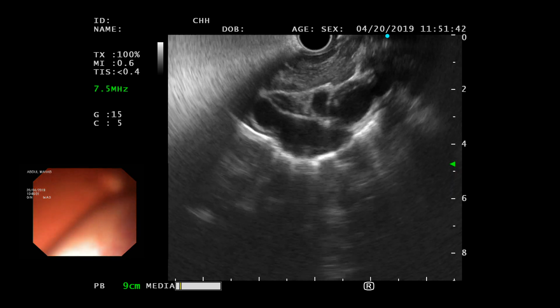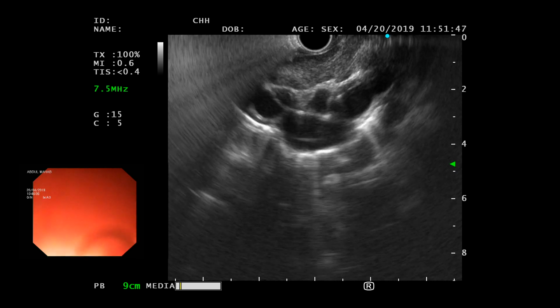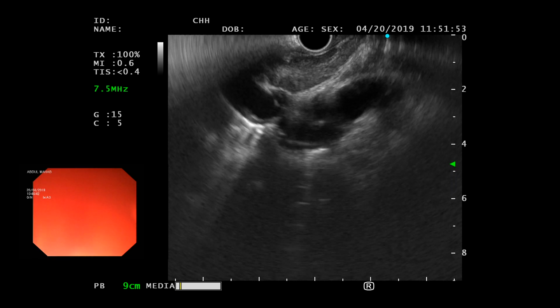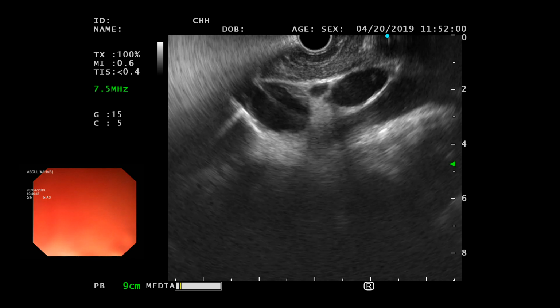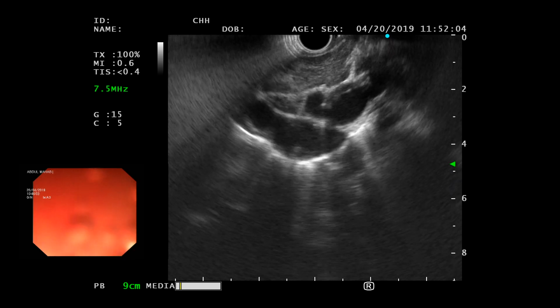You see that? They're impressive lymph nodes. There are lymph nodes also in the AP window, Khalid. I don't know if you saw. Would you biopsy these, FNA? What does everybody say? Why do you want an FNA? I'm asking you.